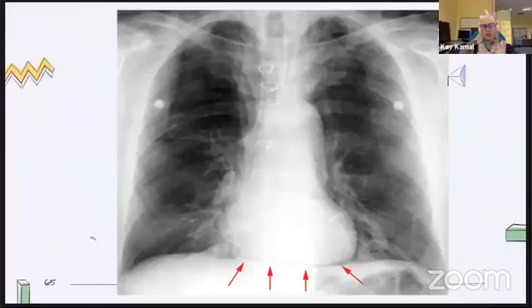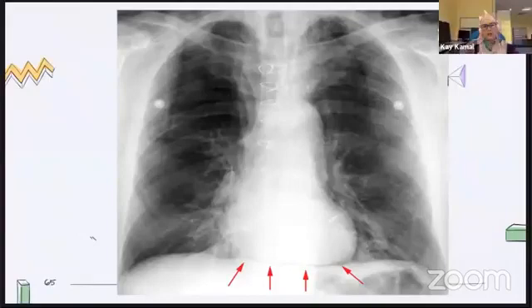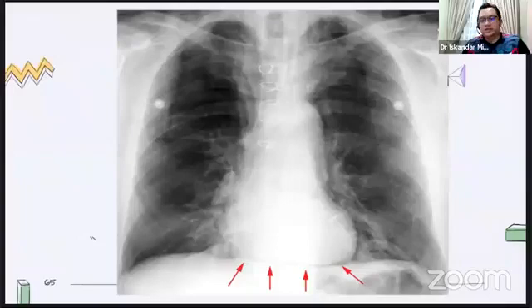It's not hard for us to interpret. To interpret something normal takes 10 minutes, even 5 minutes, but the loss is on the patient's side. Poor thing has to be radiated and cannulated for no reason, sometimes 3-4 pokes, things like that. So the best one is to get a proper inspiratory film. Yes, okay.